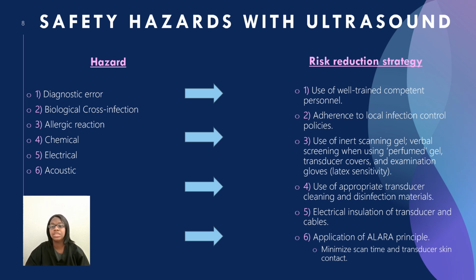Allergic reaction. Check with the patient to make sure that they are not allergic to the ultrasound gel, if they are sensitive to latex, if they are sensitive to the transducer covers, any type of gloves that you will be wearing. Chemical hazard, use of appropriate transducer and cleaning and disinfecting the transducer and any other materials is required.